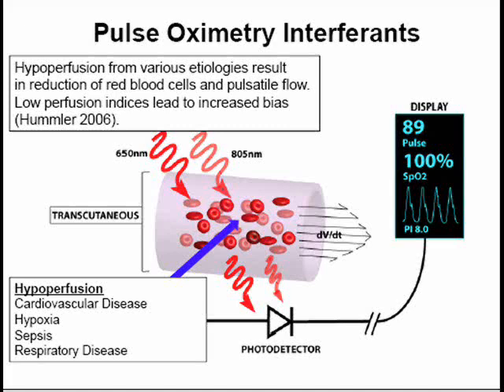To build upon this, one might wonder why hypoxia is a potential confounding factor in pulse oximetry. Well, as stated previously, as you fall below 85%, there's a greater and greater error rate in your results. Your perfusion index, for example, may be altered. So your results become more unreliable, and the only way to confirm what your results are, or to deny what your results are, is to do a blood gas test. And this is what the clinical world will push towards when you are not appropriately thinking that the device is accurate based on the results that you're getting.